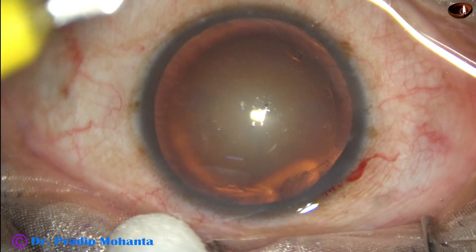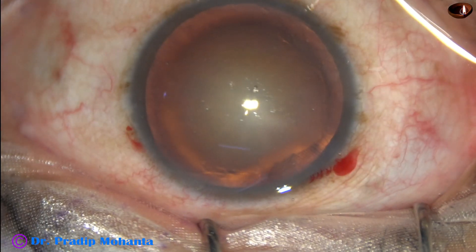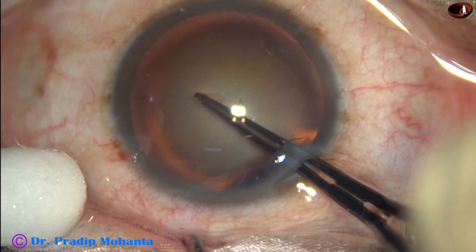A side port is made on the left side of the main incision, about three clock hours away. Capsulorhexis is done with the help of utrata forceps.